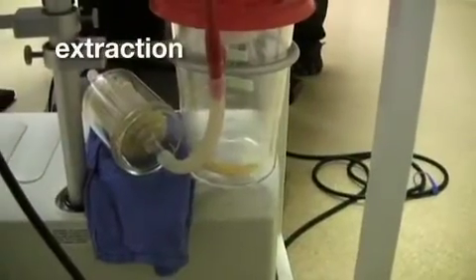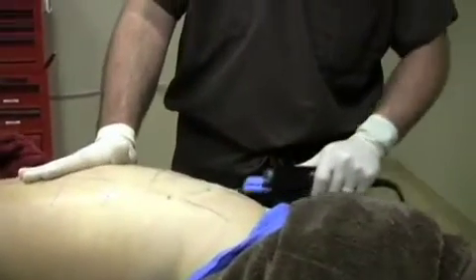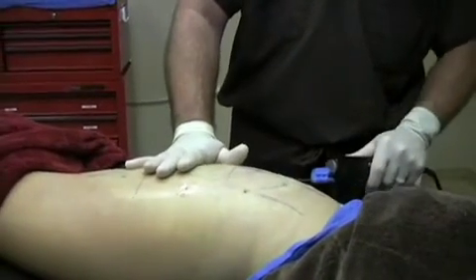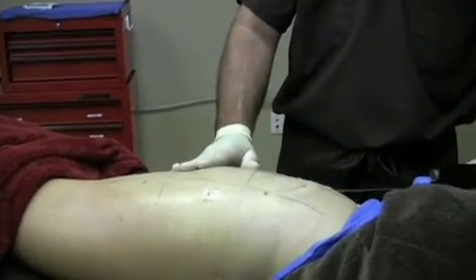You can see with this system there's a lot less work involved on the surgeon's part. The machine is doing most of the work, which on a long case you can have fatigue. And usually right at first you don't get a whole lot out. We're kind of creating little tunnels here. And then as we proceed, we'll start to get more and more out. She doesn't have a huge amount that we want to remove. Just enough. So far what we're getting is pure fat. Pretty much pure fat. A little bit of fluid will be mixed in with it.